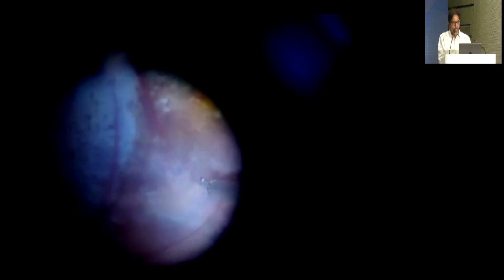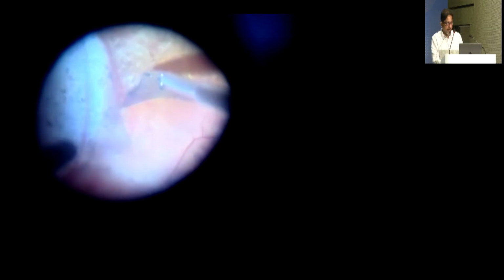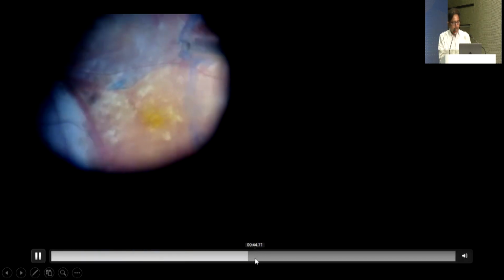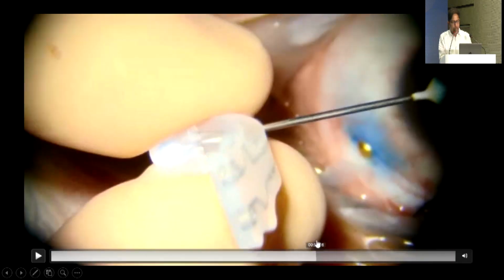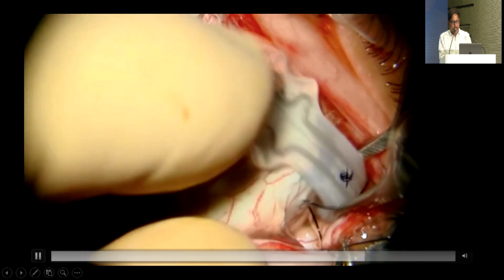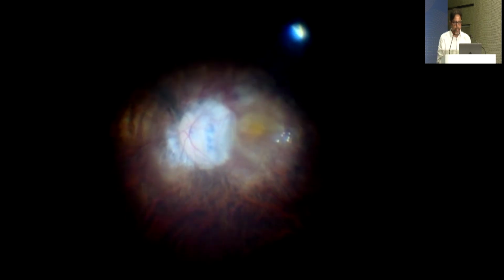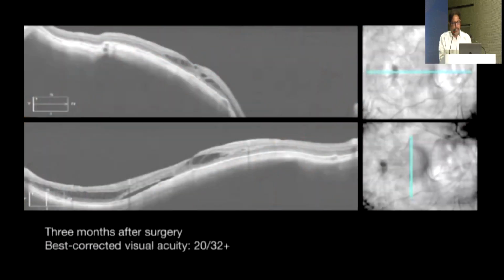So just to expose the temporal area, the superior, inferior, and the lateral rectus, and then do the ILM peel. Once you finish the ILM peel, then this is the endoplombe actually. They put a light pipe to assist in correct positioning. This is just pushed underneath the lateral rectus, and the light shows the buckle is in the correct position, and then you can just suture it.